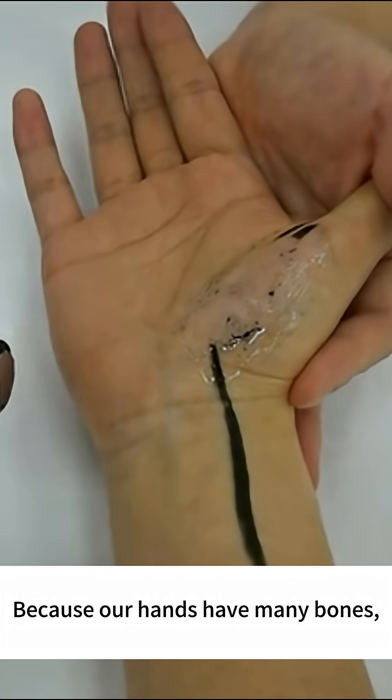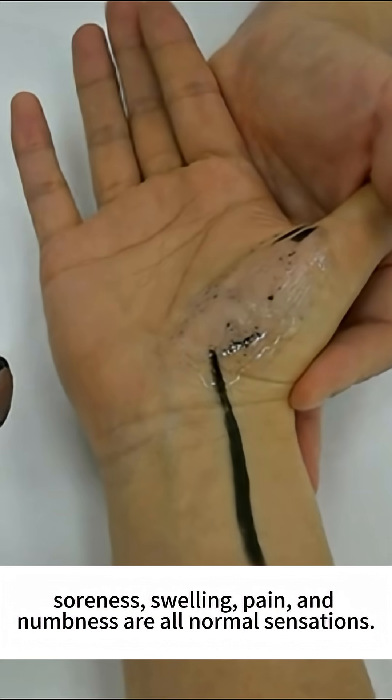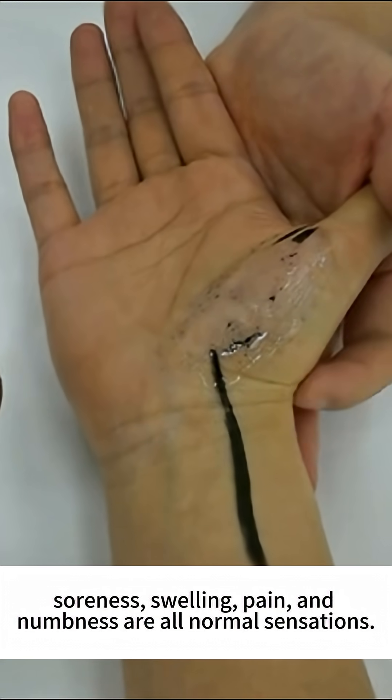Because our hands have many bones, soreness, swelling, pain, and numbness are all normal sensations.